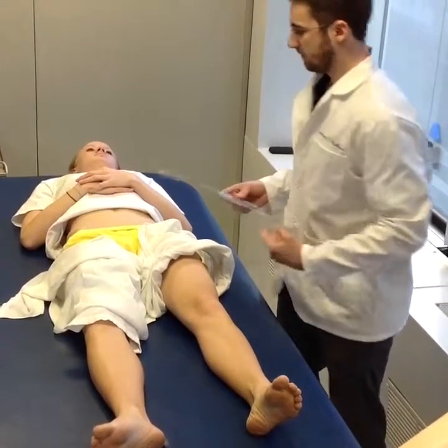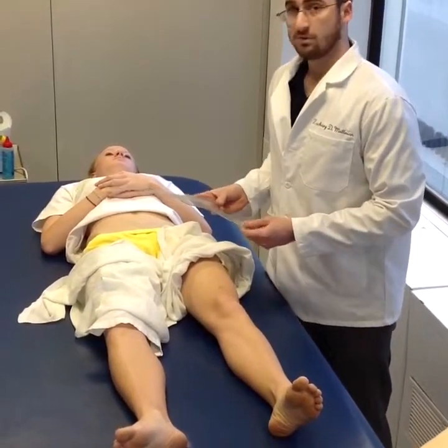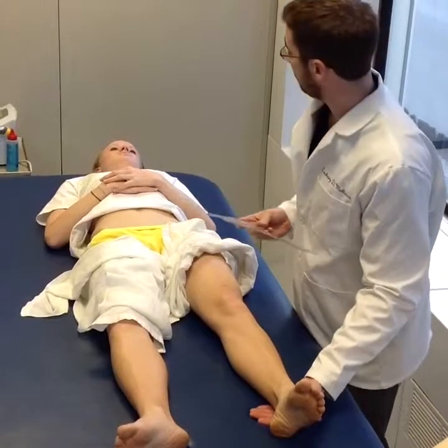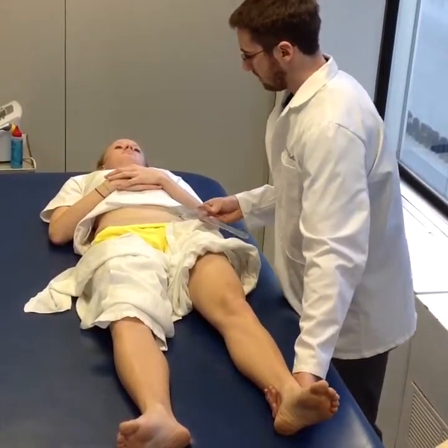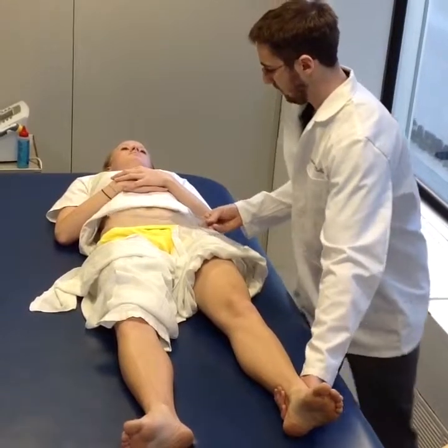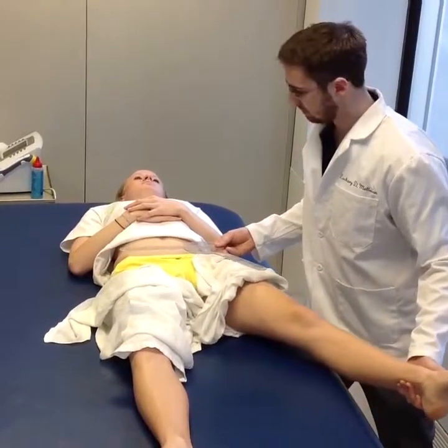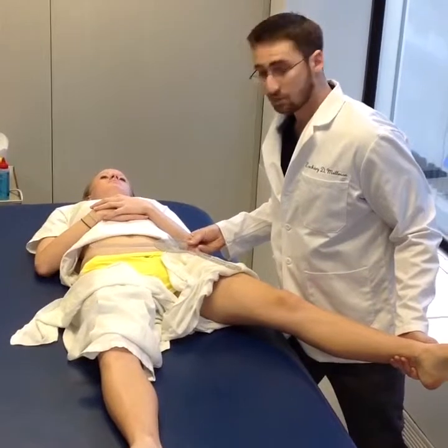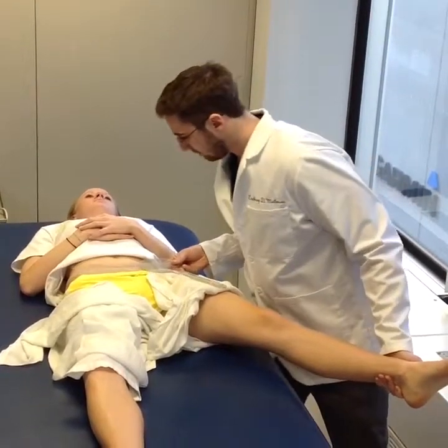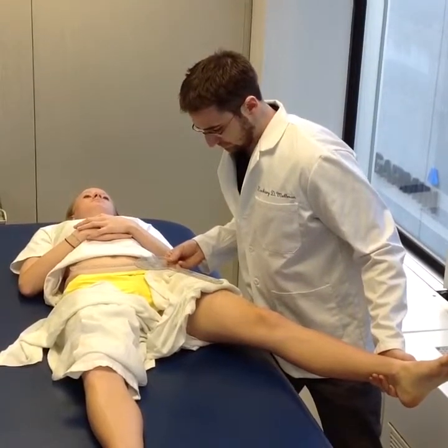I'm going to move her back and set my goniometer up. The one thing I forgot to mention in active is that the movable arm is in line with the midline of the femur, so we definitely want to have our femur exposed. Once again, I'm going to grab the ankle — just stay nice and relaxed — and I'm going to set up my goniometer. Now I'm going to move down the midline of the femur. Typically, this is actually going to produce a few more degrees than active before we get end range. Now I'm over her axis — 90 degrees, plus about 45.